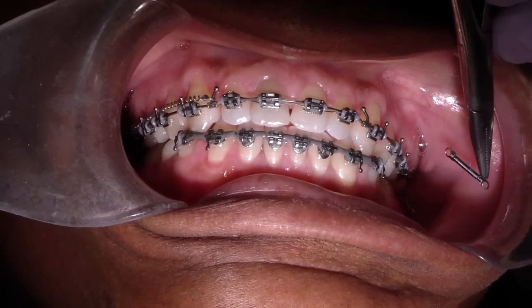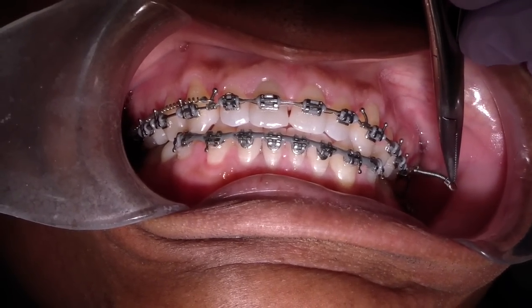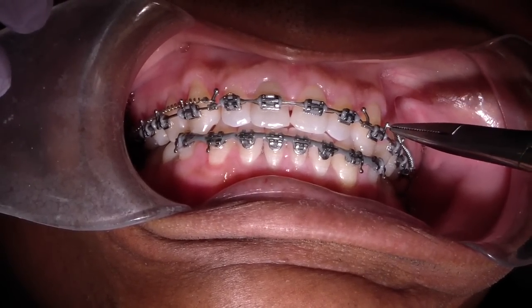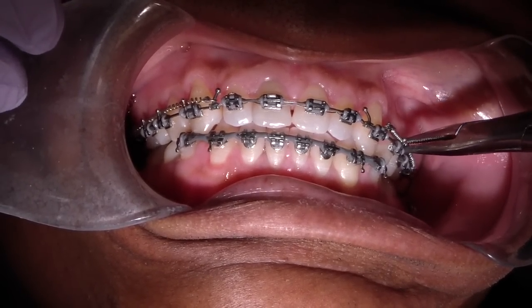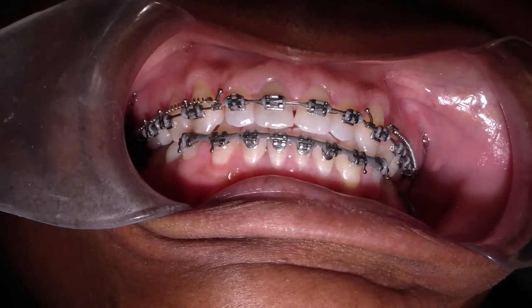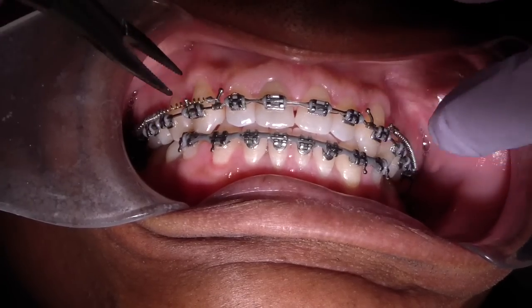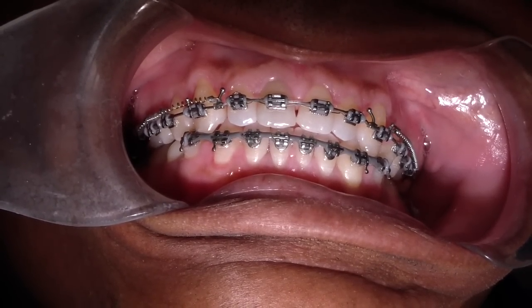We're going to place this all the way back onto the hook, the molar hook, and bring it forward to the canine and place it there. And that's it. So there you have it — we're going to continue retracting the anterior segment. Cheers.